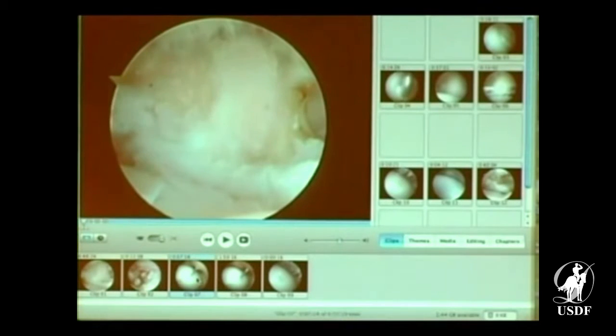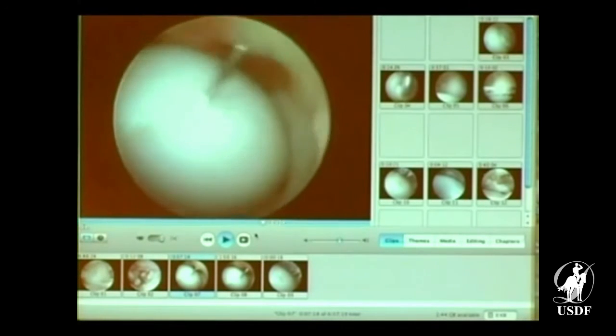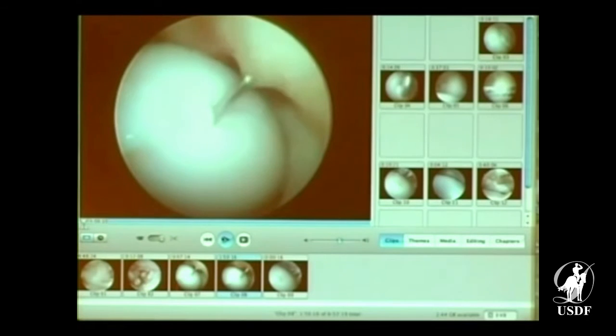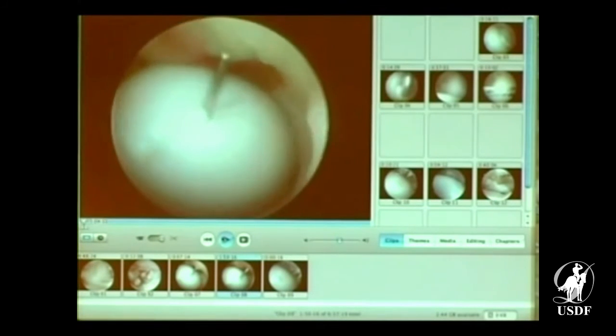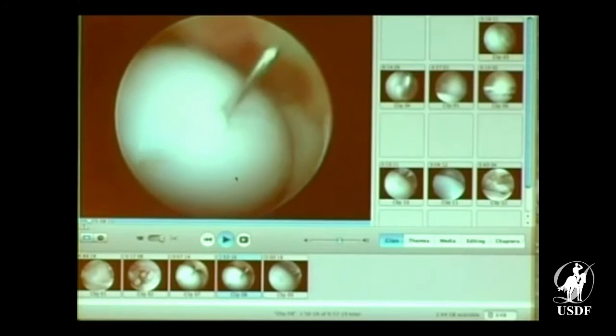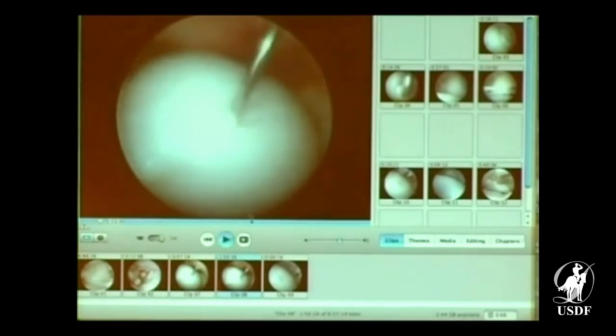Here are the cystic lesions. Okay, so this is one just last week. Again, it's a young racehorse, and that's putting a needle into the cyst on the medial condyle of the stifle. So now I don't debride those anymore. We put a needle in, and then we inject. So now you're going to see the steroid coming out. So we inject steroid into that lesion to try and help it to fill in with bone. As soon as it gets seated in there, you'll see the injection, and it'll start pooling out there. That steroid is what we use to counteract those lesions.